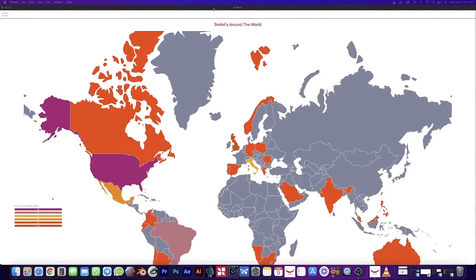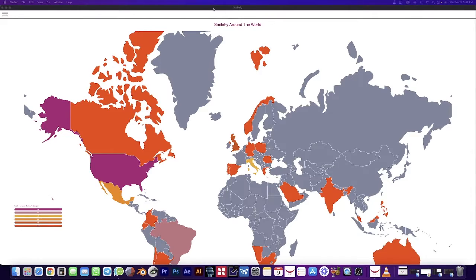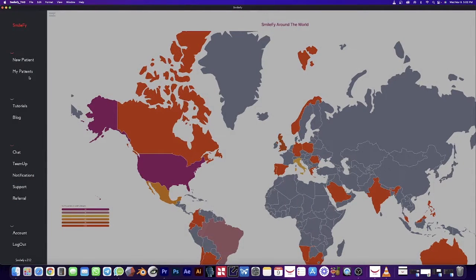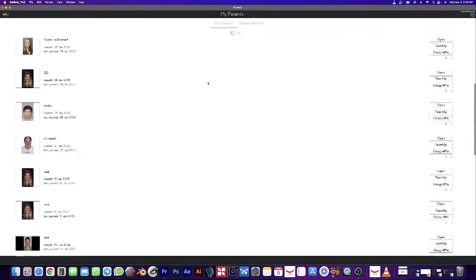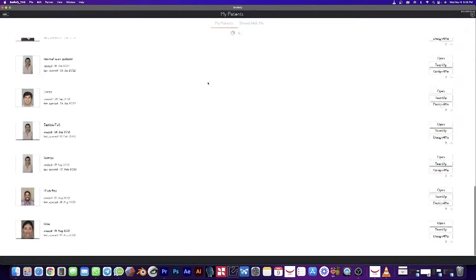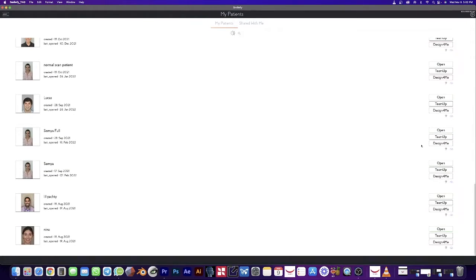With our new 3D printing connections in Smilefy, you can send your files directly from the Mac version to your software. First, we go to your patients and open up the patient of your choice.